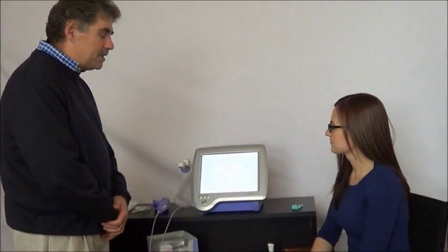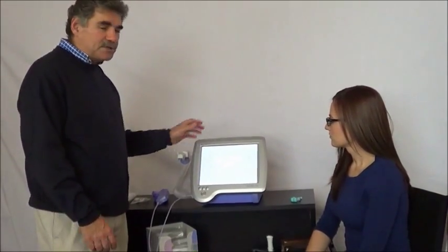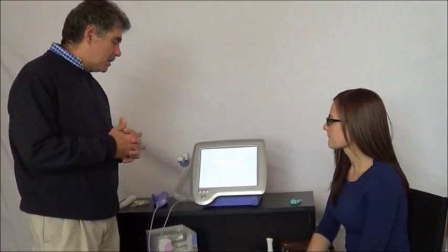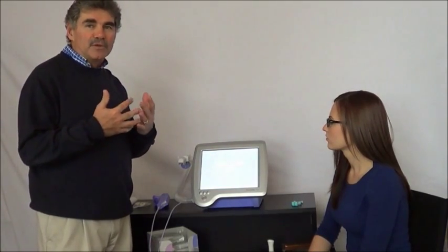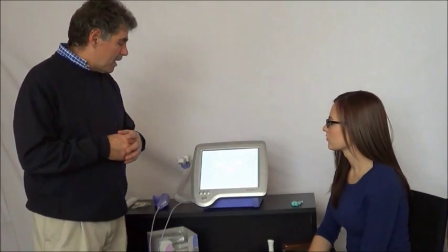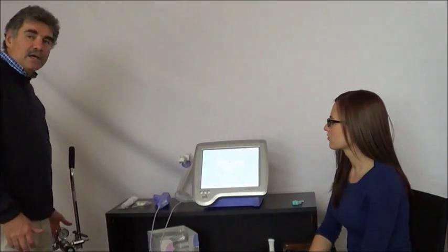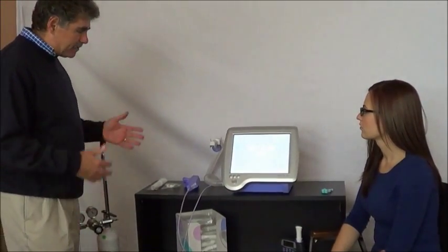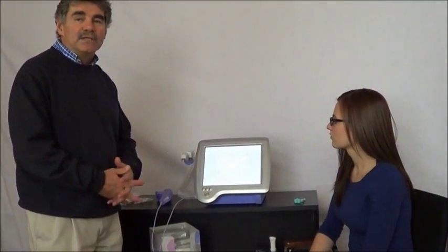Now we're going to demonstrate the DLCO test on the EZ1 Pro device. The DLCO test is a pulmonary function test where we're analyzing the ability for your lungs to move oxygen from your lungs into the bloodstream. It's a test that involves inhaling a known concentration of gas, having the patient exhale that gas, we analyze that gas, and from that we can make a DLCO measurement.